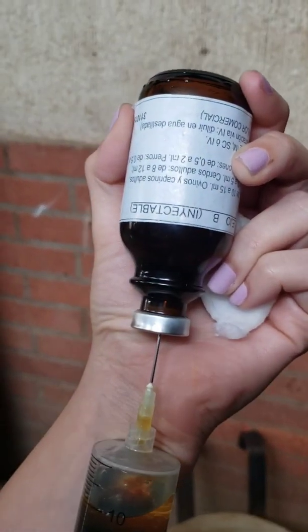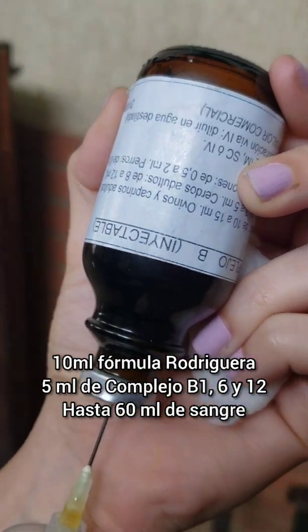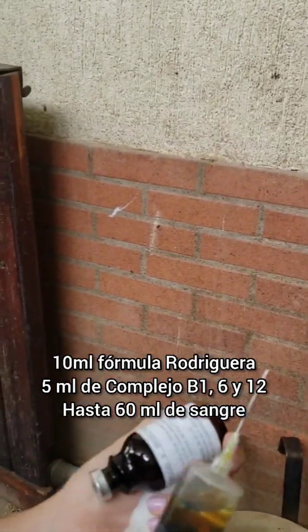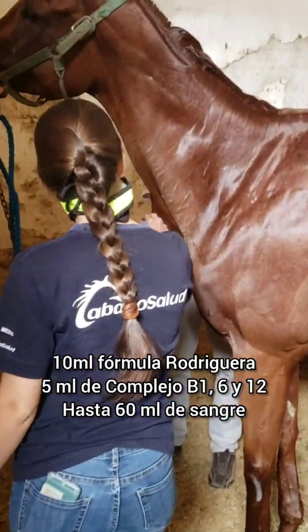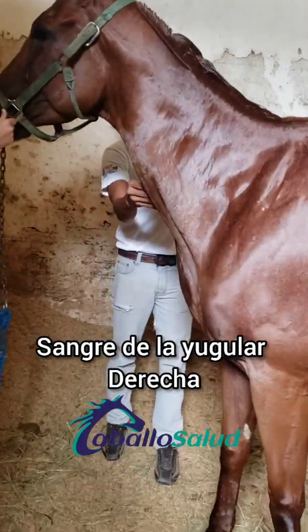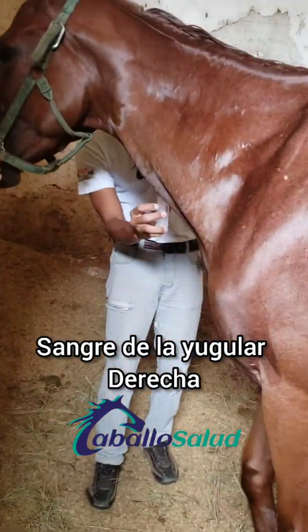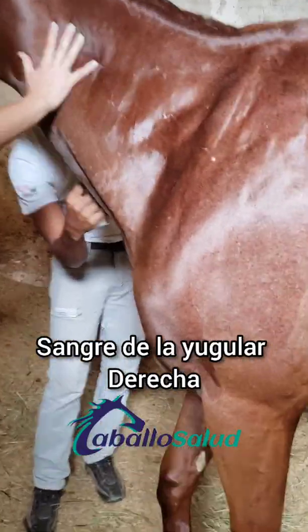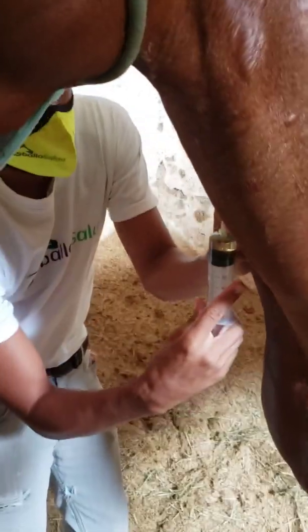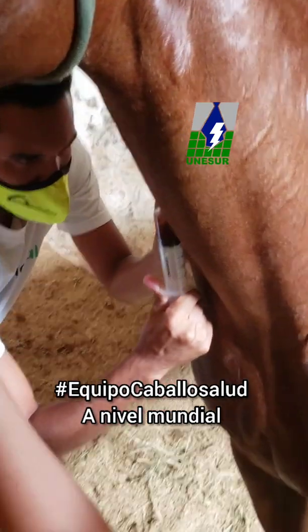We are going to do a special complex that I have done with my brother. She is a very picky, very dangerous animal. When she sees a needle, she is very extremely difficult to inject. So this is Luis Larea at Caballo Salud Larea on social media.